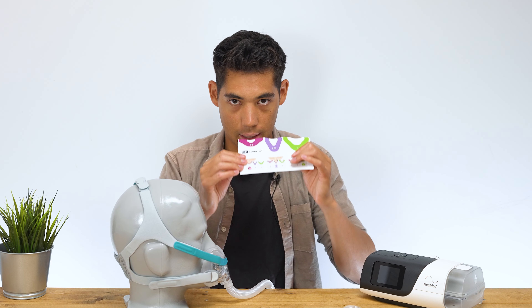Now that we've looked at the mask, here's what I think of it. The back is pretty good and pretty secure — I like that. The front part I feel could have been edged up slightly. On the mannequin, if I push it down you can see it kind of flops down, and I feel kind of the same way when it's on my head. They have a lot of points strapping it to the back of the head but not so much at the front.